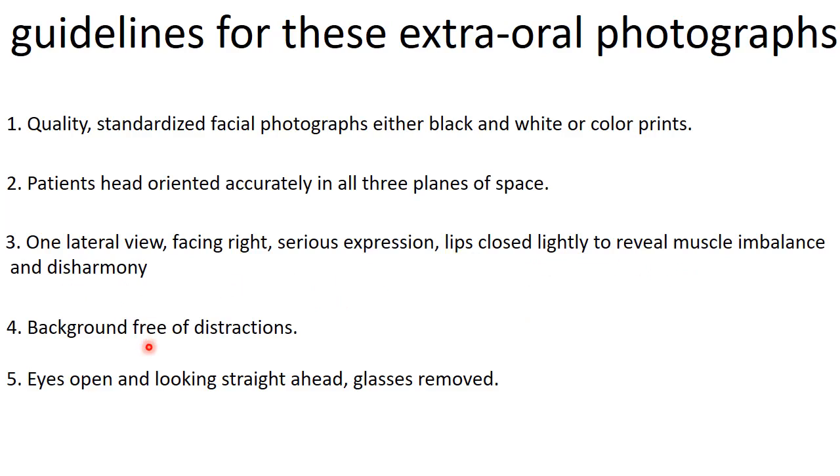Lips are closed slightly to reveal the muscle imbalance and disharmony. The background should be free of any distractions; most likely it is white and clear of any distraction. And the eyes are open and looking straight ahead.